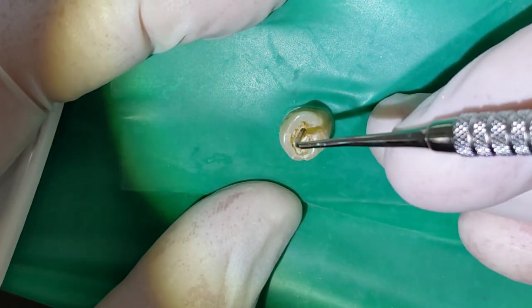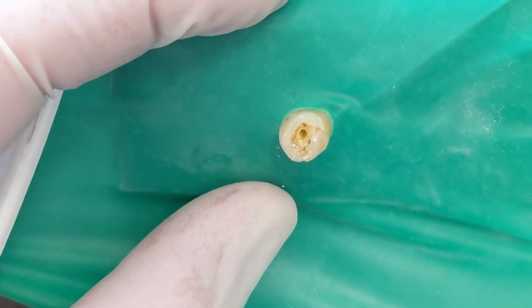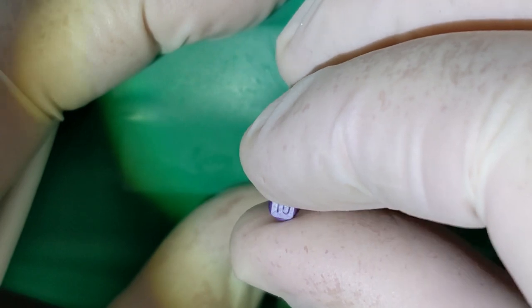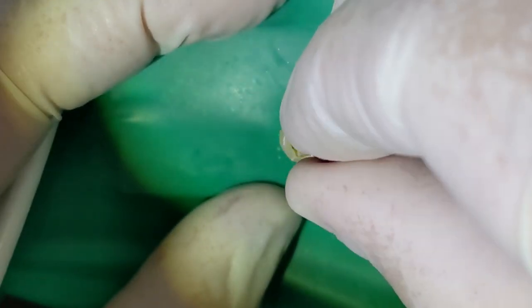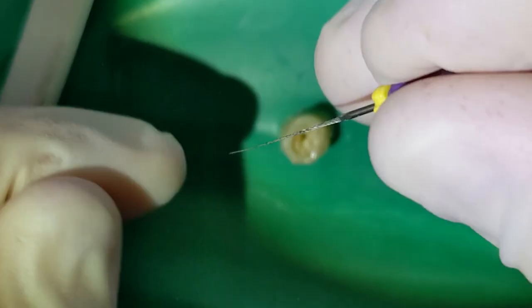Let me check to see if we're in there. I think we are. I'm going to use my number 10 file to see if I'm into the nerve chamber. There we go, into the chamber. Let me just open that chamber a little bit more.